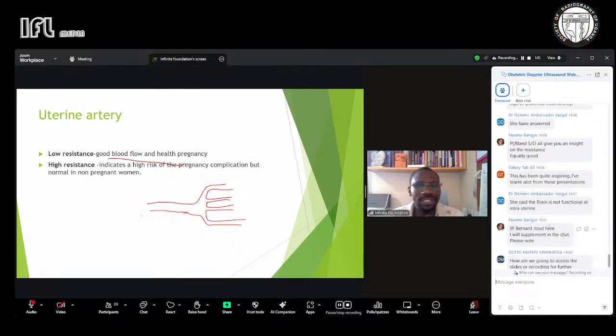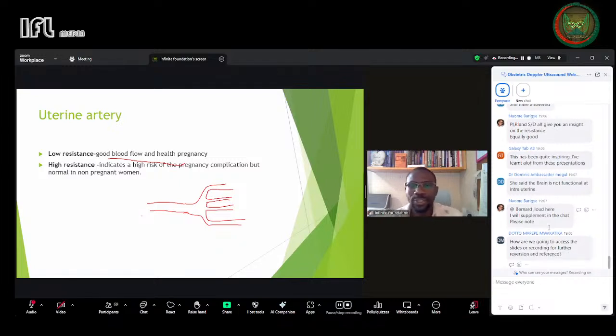The first question, when we think about resistance, resistance is in 2 phases. It can be in a series. So if we take the measurement here, we are going to focus on only what is happening here, where it is serving.